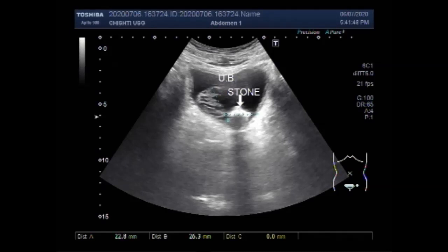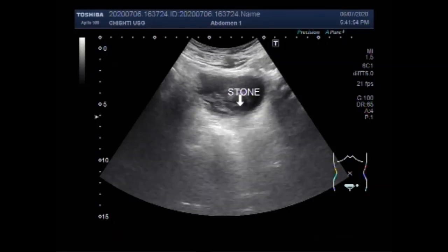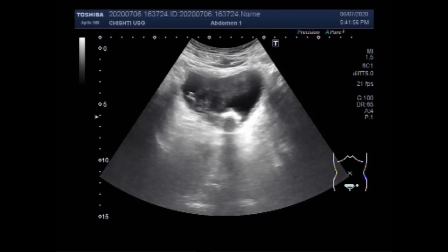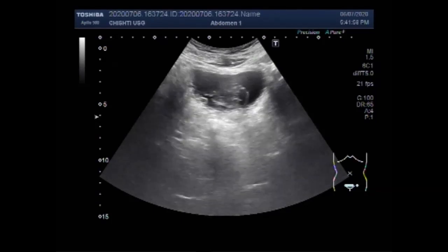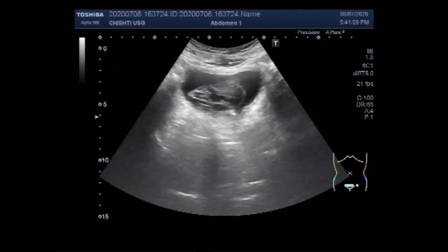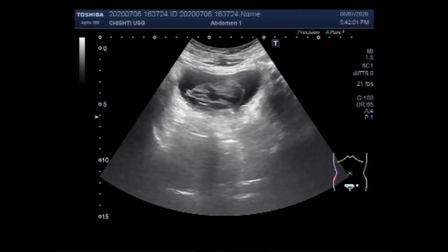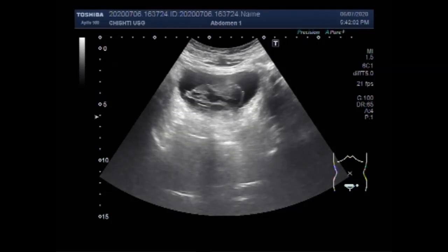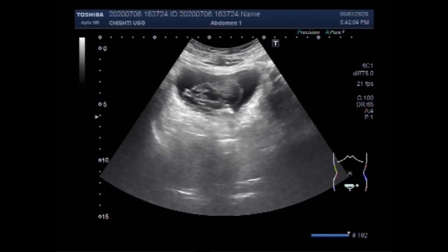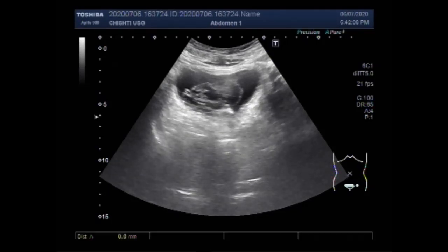Bladder ultrasound can show how much urine the patient holds, whether it is full, and whether someone completely empties the bladder when urinating. Bladder ultrasound is often done along with an ultrasound of the kidneys.